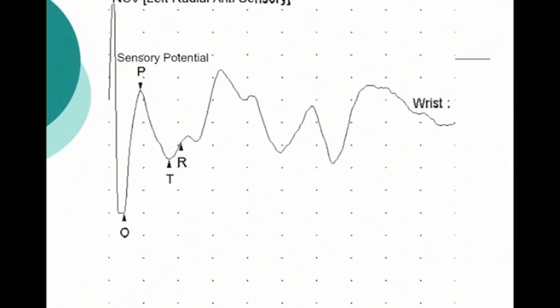And the machine indeed went and put the O at the bottom. That's not true, obviously. The O probably should be here. I'm guessing here, but that's where the onset probably is. The P is where it should be. And because the O and the T are preferably symmetrical to each other, I would put the T where that red arrow points out to.